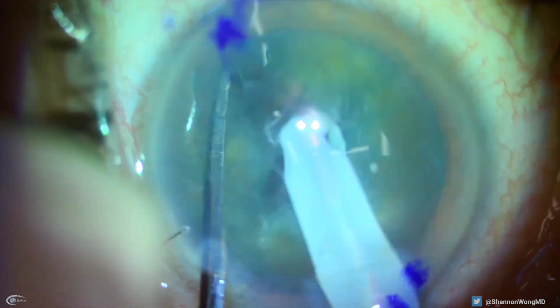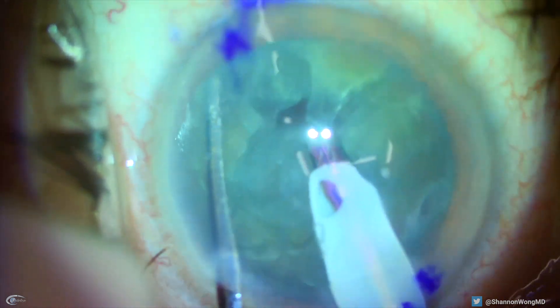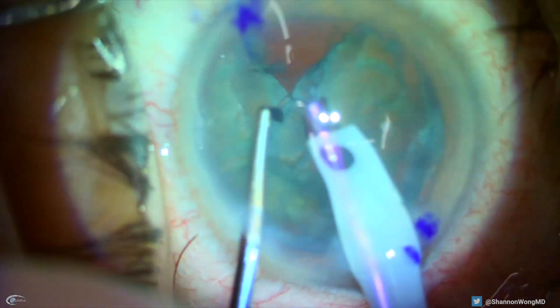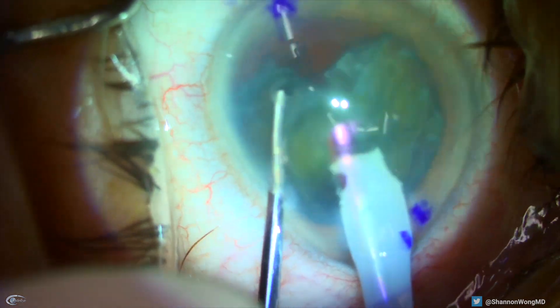Then we rotate the other hemi-nucleus into position and place our chopper for a horizontal chop. But the problem is that I placed the chopper too far peripherally and most likely engaged the posterior capsule. My mistake. So the capsule is torn at this moment.